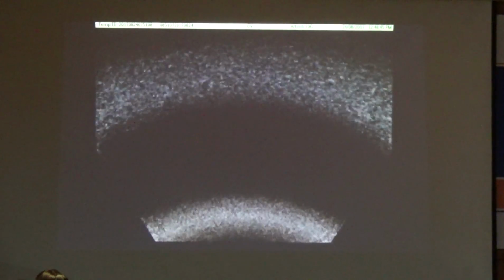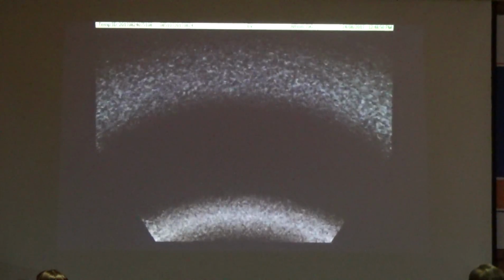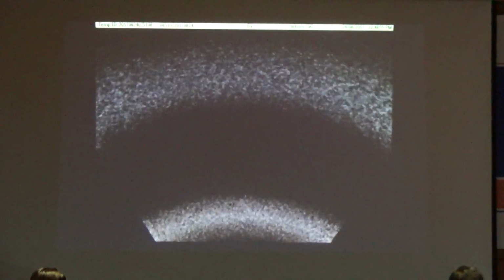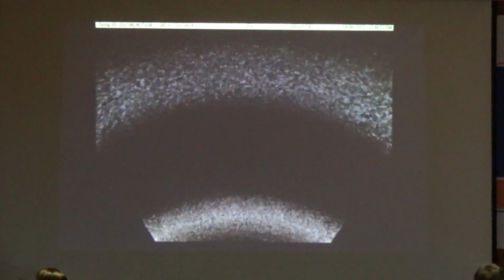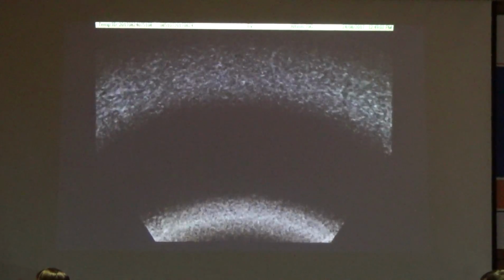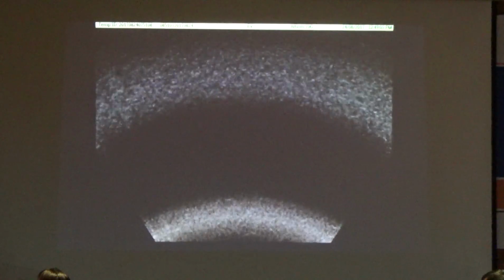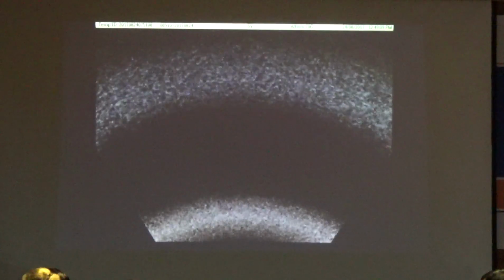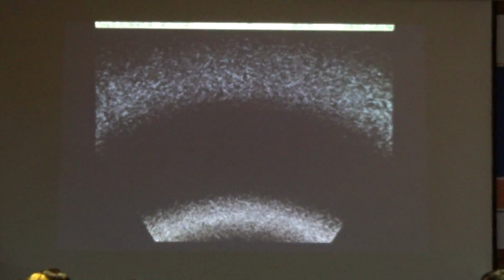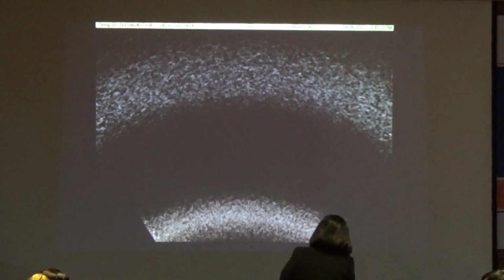I'm just getting beautiful pictures. It's not the problem. It's not the frequency of the transducer. So let's see. If you had a woman like this, let's say I'm a wonderful echocardiographer. There's two things we could do. We could let you sit down and do it, because you're better than me, or we would get the patient to go for a walk. Because by changing her position, you maybe change the position of the fetus and you get a better look at the arch.